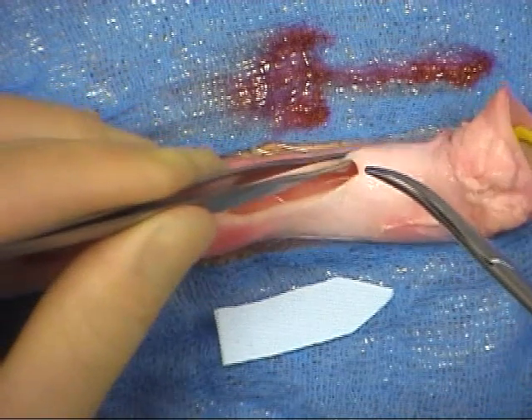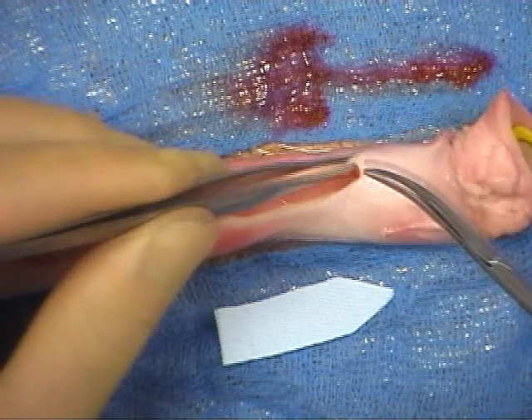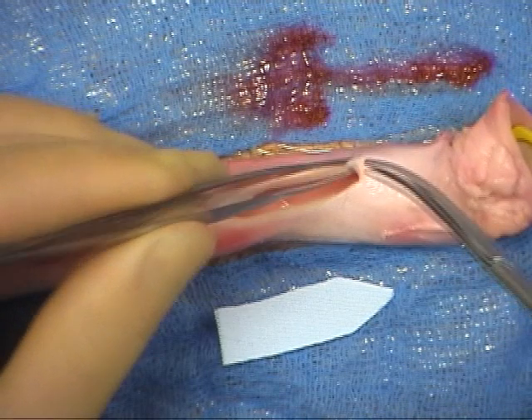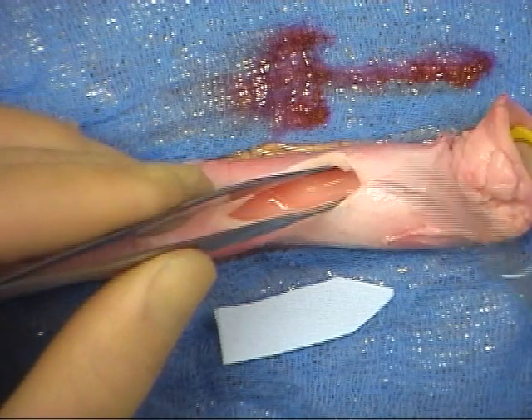However, the full thickness of the vessel wall must not be grasped with the forceps, as this will fracture the intima, particularly in vessels that are calcified.